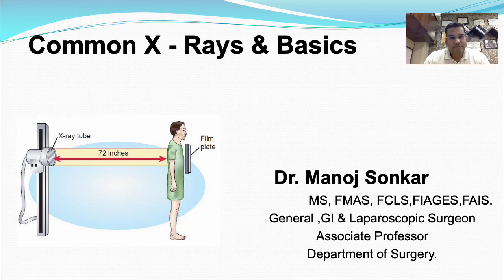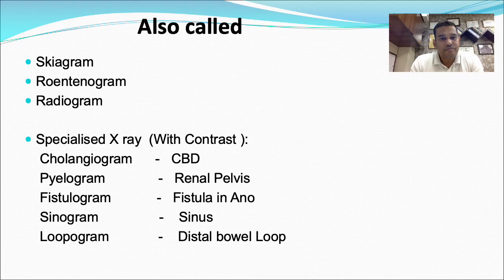Hello students, today I'll be talking on an important topic: common X-rays which we encounter in our day-to-day practice, what the basics of how you read an X-ray are, how it is done, and what are the important points you should always note when you're reading an X-ray.